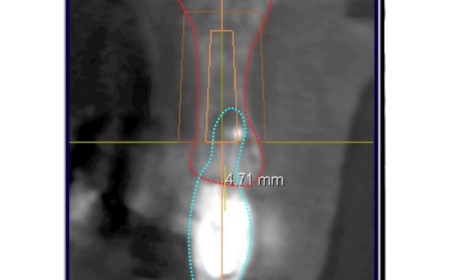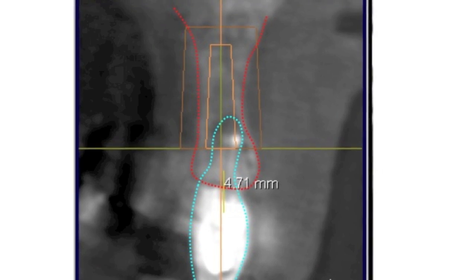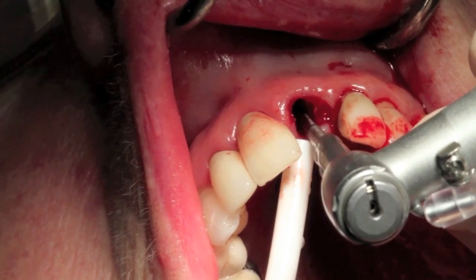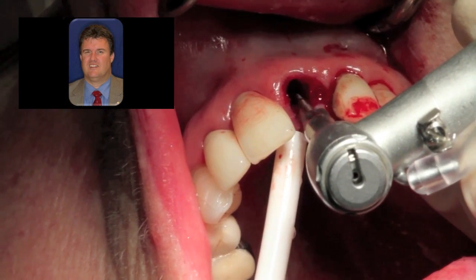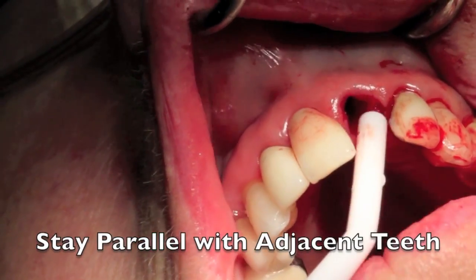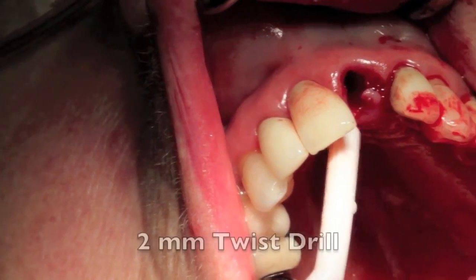So you have to notice the angle of the drill. We're using a precision drill, and we're going to angle it very much palatal and then rotate the hand as we're going in to make this go into that screw retained position. When using the precision drill, we want to maintain our vision on the two roots that are adjacent, because we want to stay parallel with these roots, but also to hit this target up inside where we were going into the palatal wall.